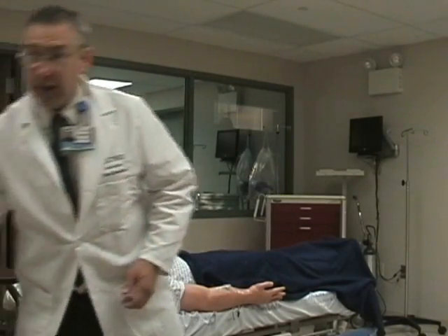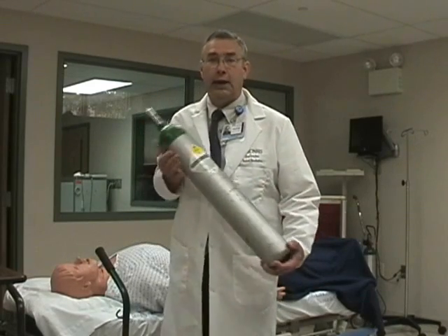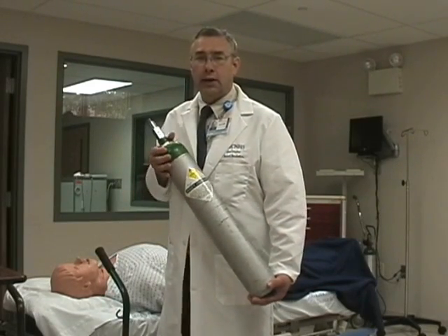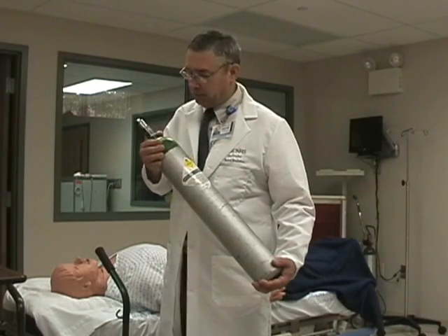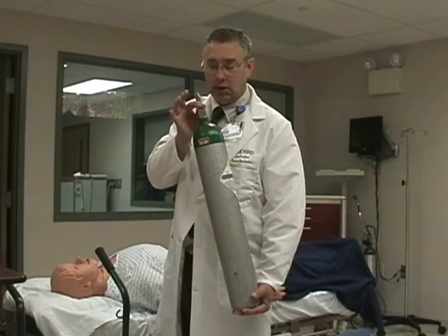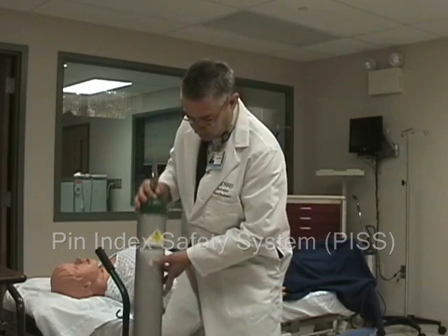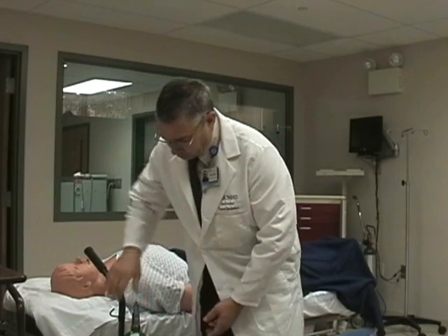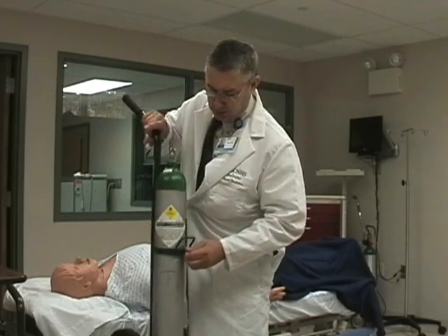In therapy devices, the first thing we're going to start with is the oxygen tank. This is your E-cylinder tank. The appropriate way of carrying the tank when it's not in a cart is securely with one hand on the bottom and one hand on the shoulder of the tank. This tank is a standard tank and has the pin indexing system on top. As you put it into the cart, you should make sure that it is secure in the cart.